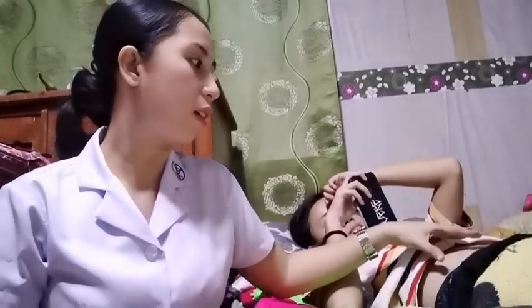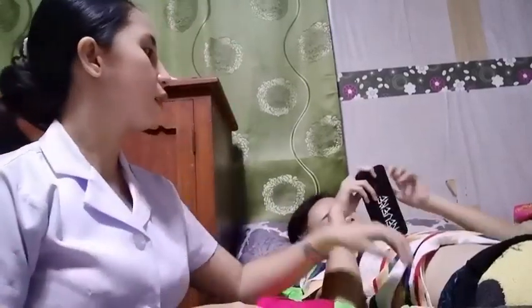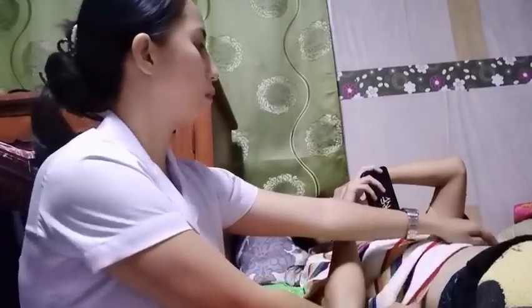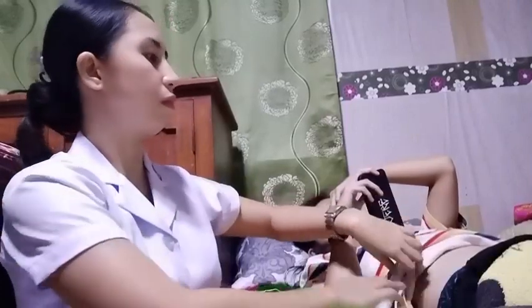Okay. To make sure that you have the right size needle, use your thumb and forefinger to grasp the skin fold of the tissue. And measure the fold from top to bottom to ensure that the needle is half as long. We now place the patient into a comfortable position and now apply the clean gloves.